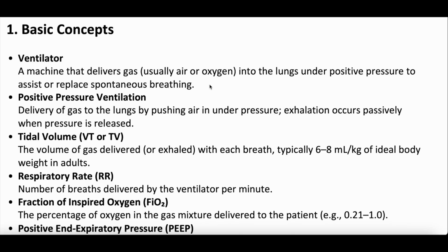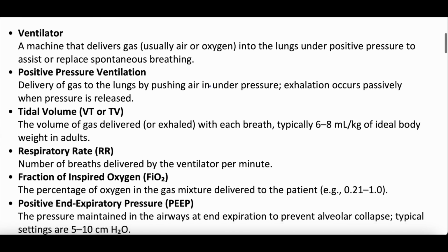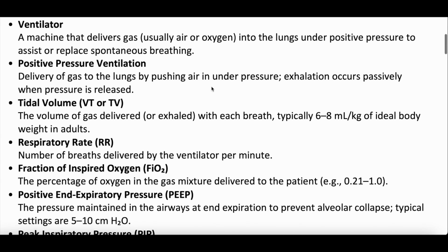Positive pressure ventilation is a concept where gas is being delivered to the lungs while under pressure. Okay, positive pressure ventilation. We're ventilating the lungs under pressure. This can be a BiPAP or CPAP mask. You have a sealed mask on the face that then provides gas to the lungs under a certain pressure. In positive pressure ventilation modes, exhalation usually occurs passively. Okay, think about that. Exhalation occurs passively.